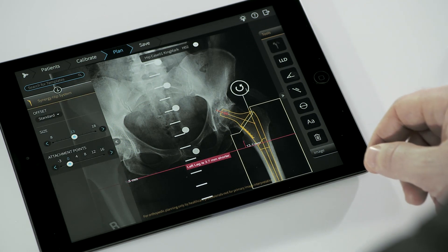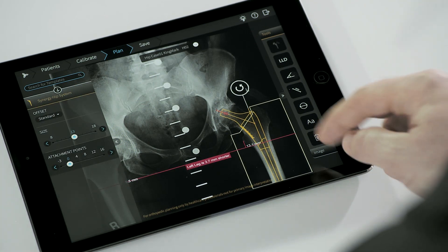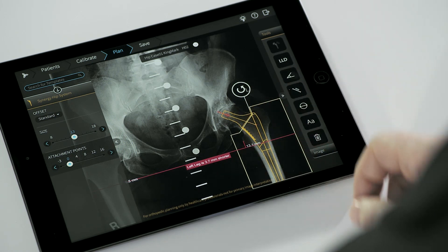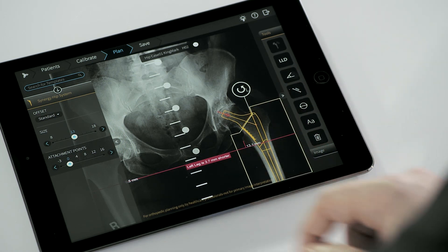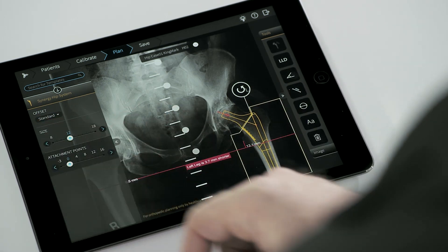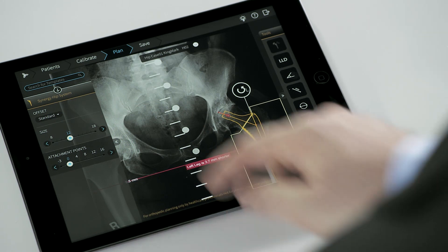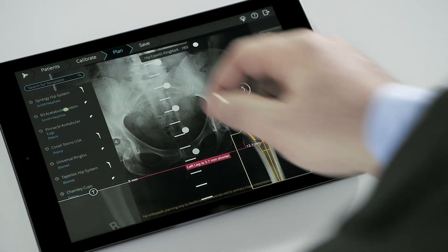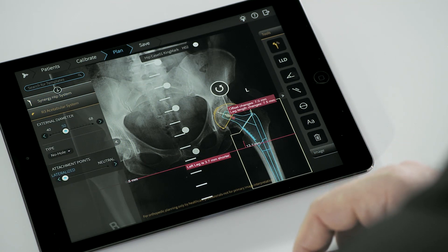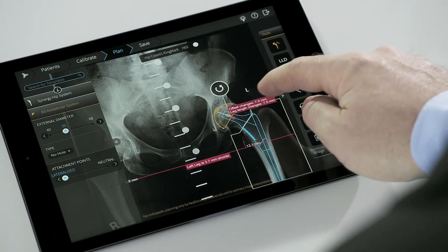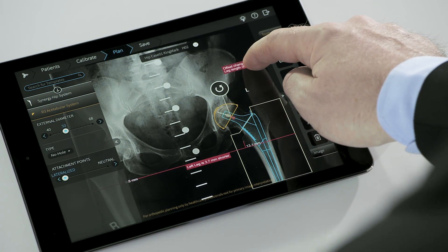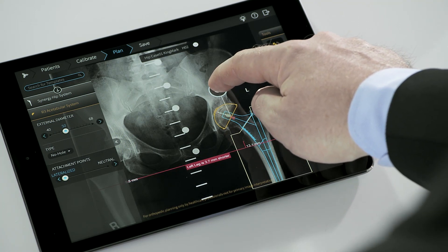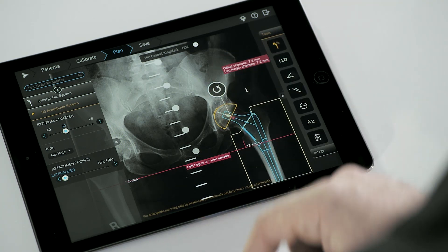Once the template is added, the auto-hip functionality detects the lesser and greater trochanter, the femoral axis, and inferior ischium. Automatically, the software displays the leg length discrepancy line and places the stem in the femoral canal and the cup in the area of the acetabulum. In addition, a fragment is created according to the suggested femur head osteotomy line.